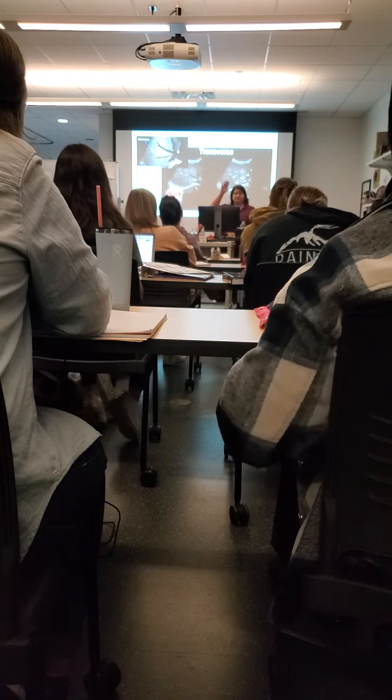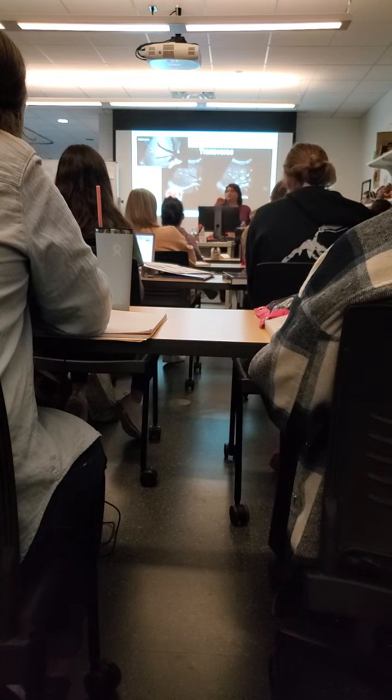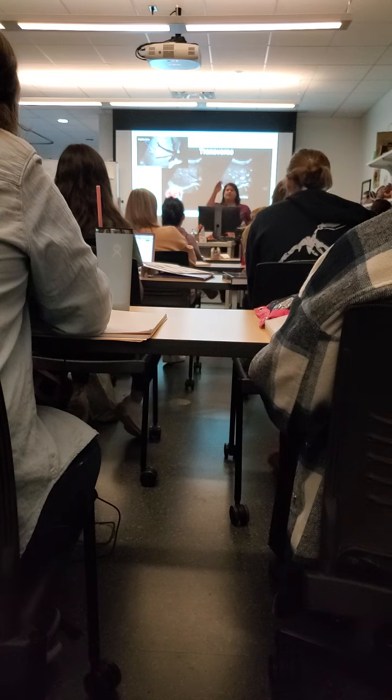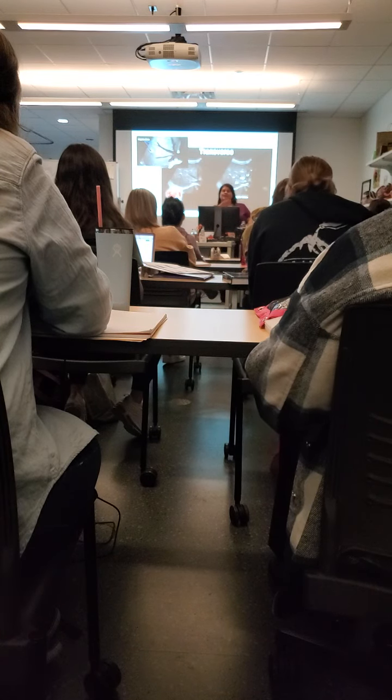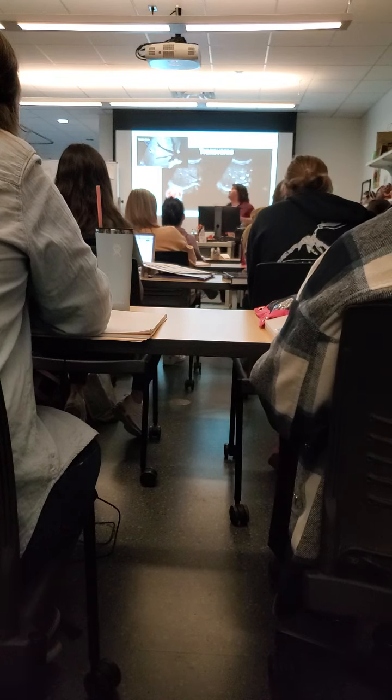We are standing transverse and a little bit to our right. Pretty high. So when I am scanning, I do my transverse, or I do my left lobe of the liver. I go sag, 1, 2, 3, and then a transverse, 1, 2, 3. You guys will learn that in lab. And then, right before I go to the right, that's where I do my hepatics, because it's right in the middle, and I do it in transverse. I just move my probe a little bit up, and then boom, you'll get this beautiful image. So practice.